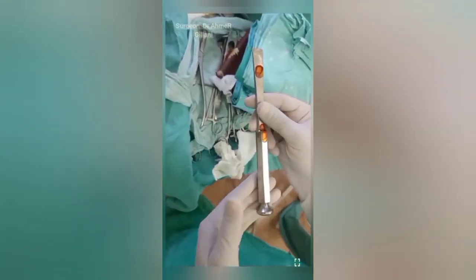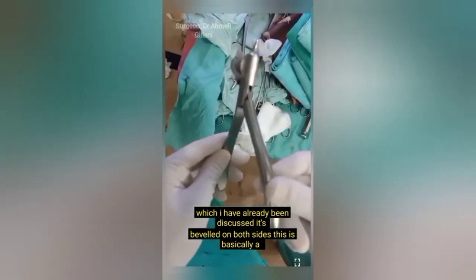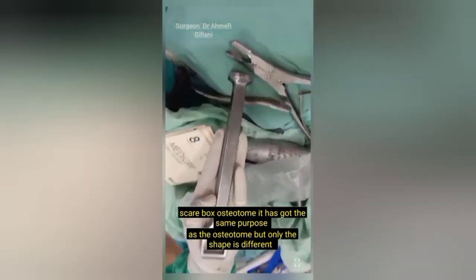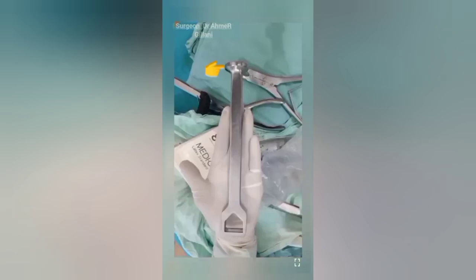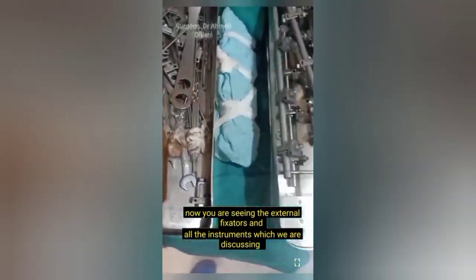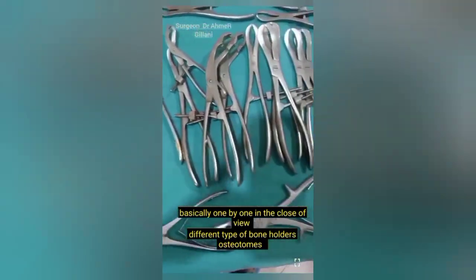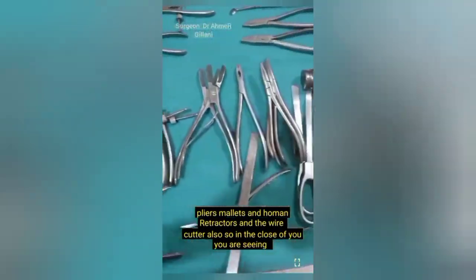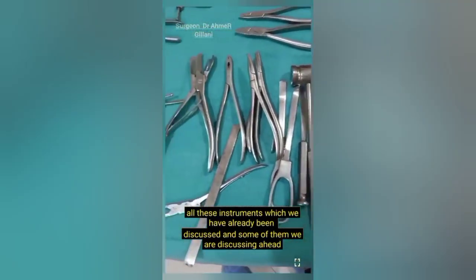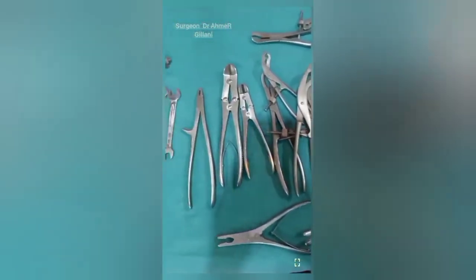Again you are seeing the osteotome on your screen — beveled on both sides as previously discussed. This is basically a square box osteotome, which has the same purpose as the osteotome but only a different shape. Now you are seeing the external fixators, and all the instruments being discussed — different types of bone holders, osteotomes, pliers, mallets, Hohmann retractors, and wire cutters — are visible one by one in close-up view. Some of them are being discussed further ahead.